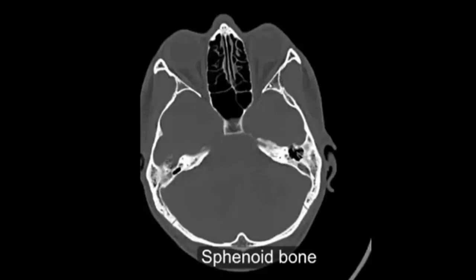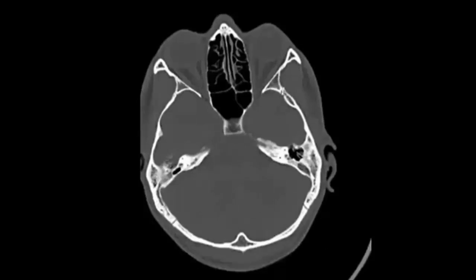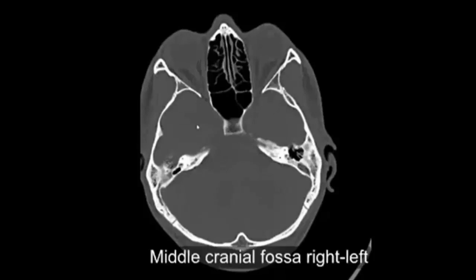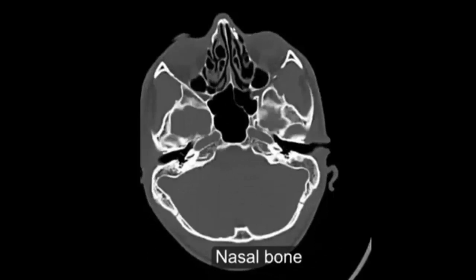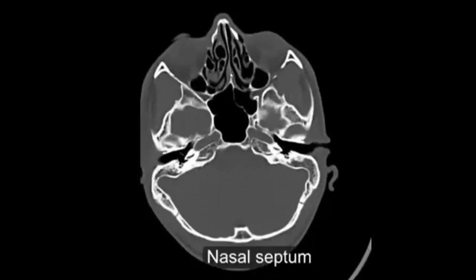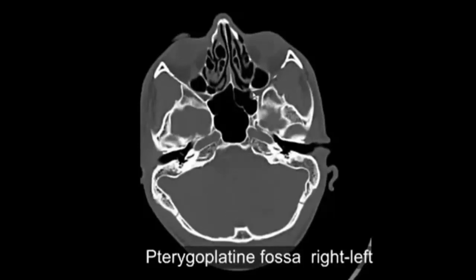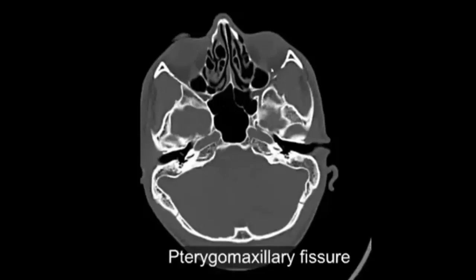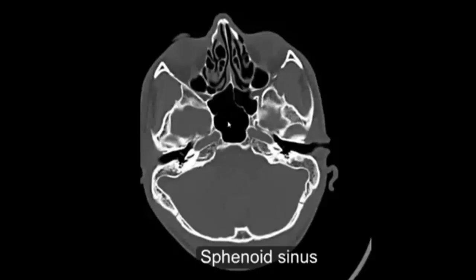Sphenoid bone, sphenoid squamous suture, middle cranial fossa, right and left nasal bone, nasal septum, ethmoid cell. Pterygopalatine fossa, right and left. Pterygomaxillary fissure. Foramen rotundum. Sphenoid sinus. Infratemporal fossa.